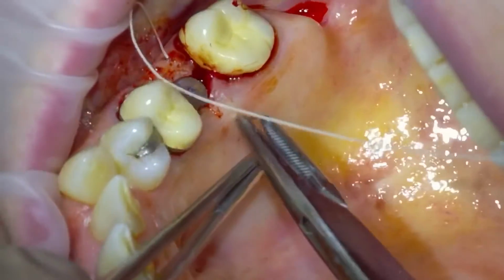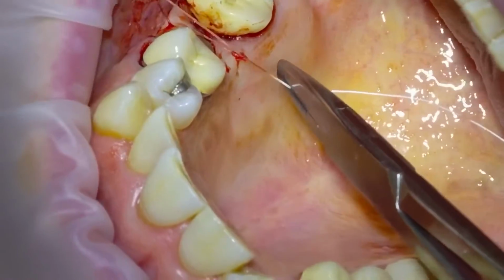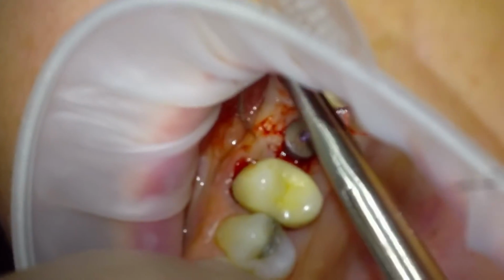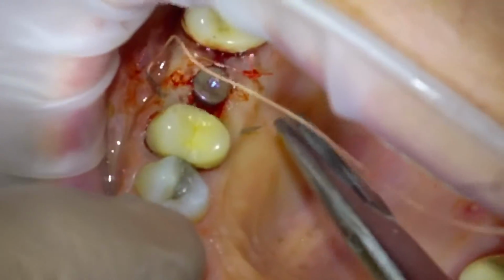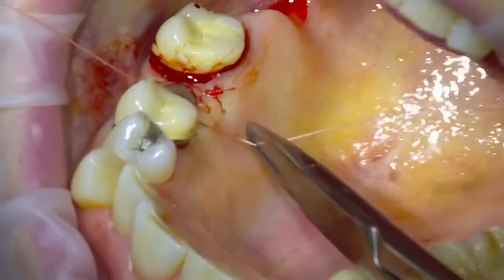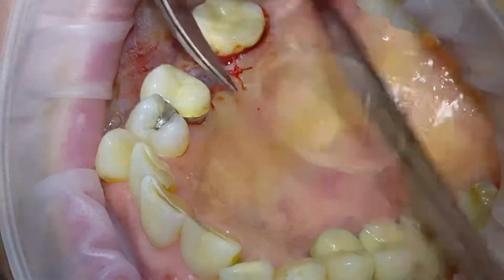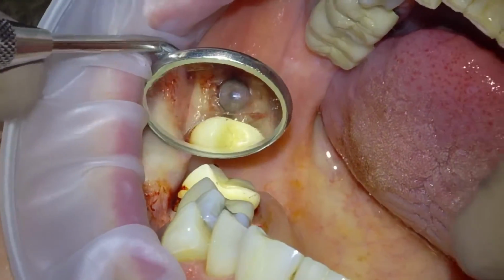There we go. Very, very simple. It's got a lovely little drill sequence, good primary stability, and it's quite a great implant for type 4 bone, where bone is less dense, so primary stability can be potentially compromised a little bit. The flutes of BLX offer excellent primary stability, and then that's the site closed.